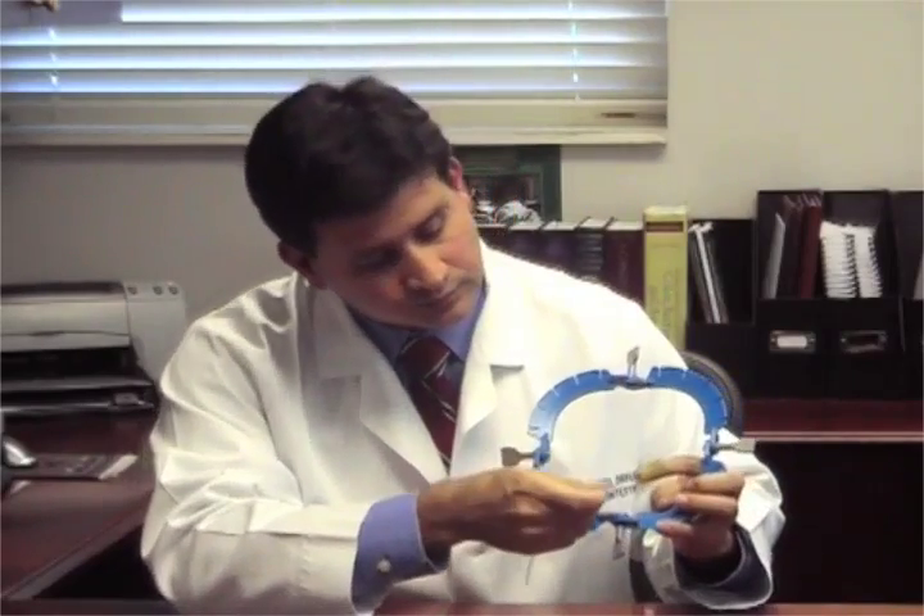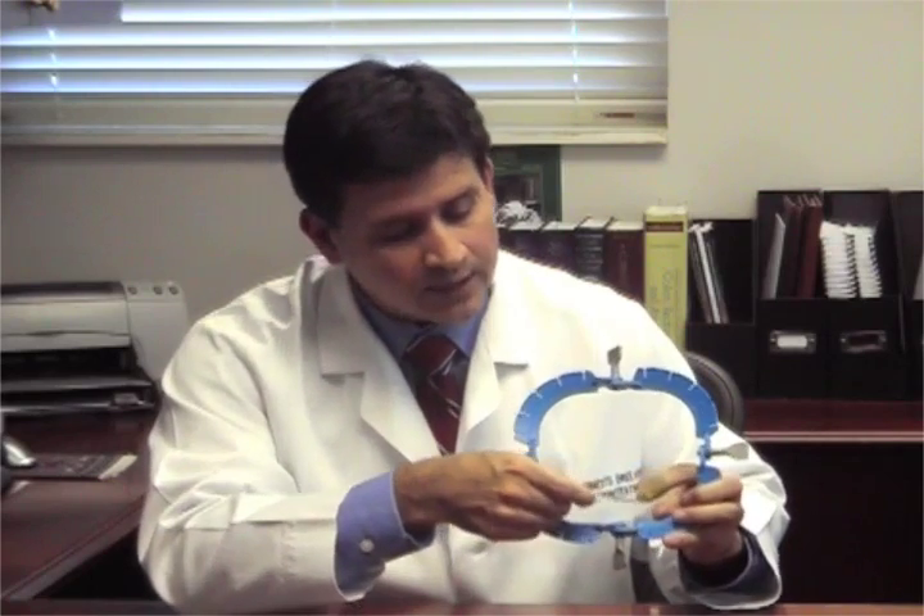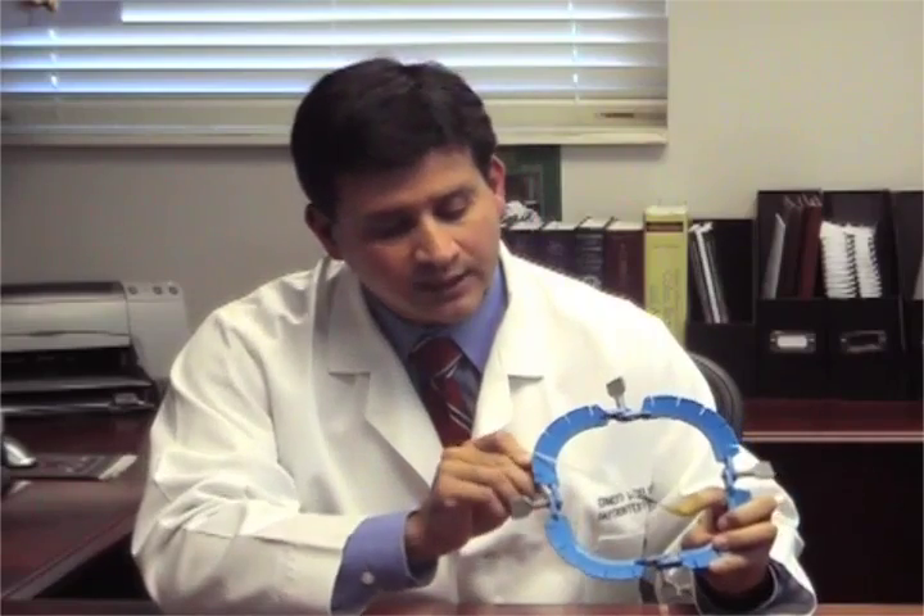I like the 5mm stays with the sharp hooks. I apply these to the anoderm like so. And then you can choose the amount of tension that you want and just attach it to the slots.